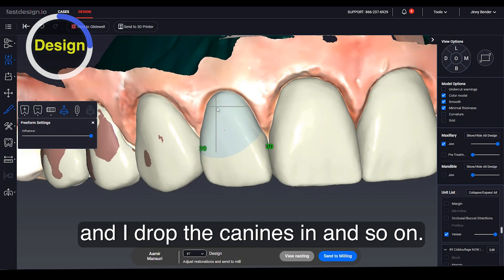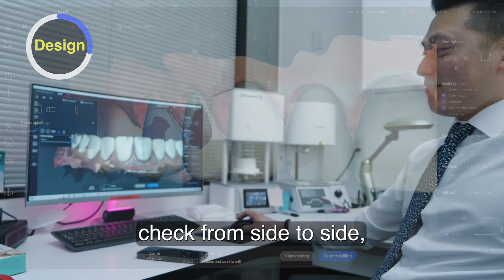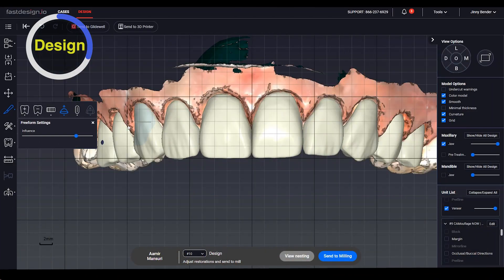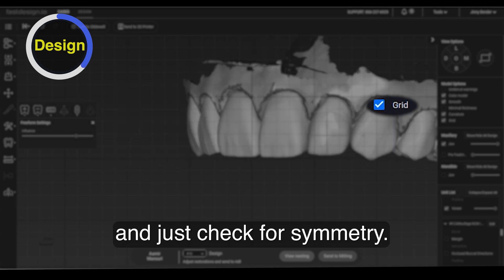So then I drop the laterals in, I drop the canines in, and so on. I just check from side to side, making sure everything flows. In the software, you can see there's a grid feature where you can visualize and just check for symmetry.